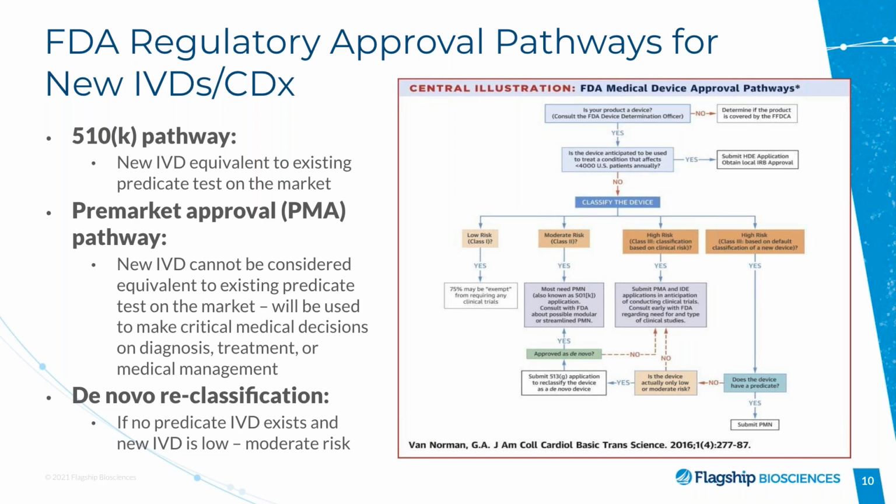So the clinical validation process of this test is, of course, very important, because you want to make sure that everything you do is consistent with the level of quality necessary for this very complicated and serious undertaking. So from the point of view of the analytical and clinical validation of this test, one thing that is extremely important is actually to have a very large number of specimens. And this is actually true for two reasons.